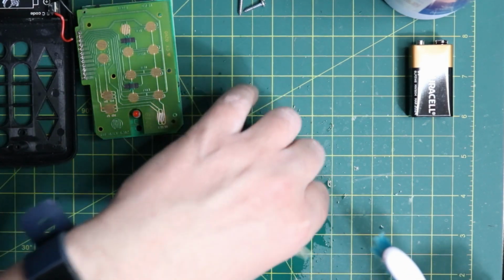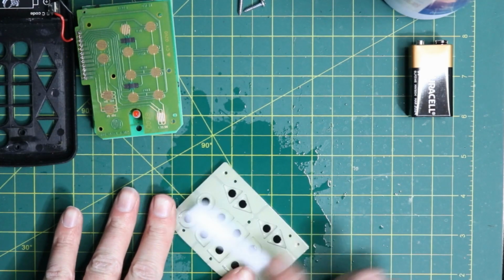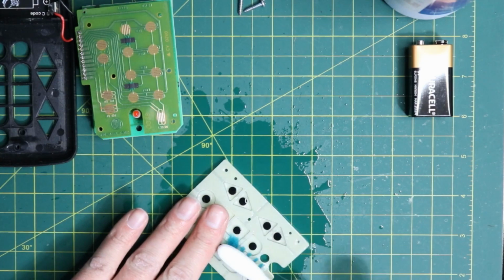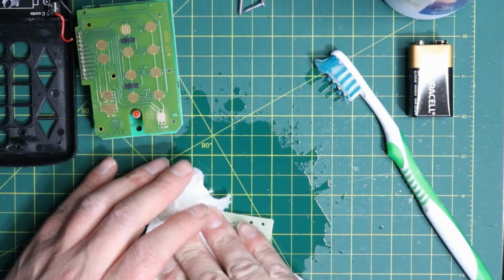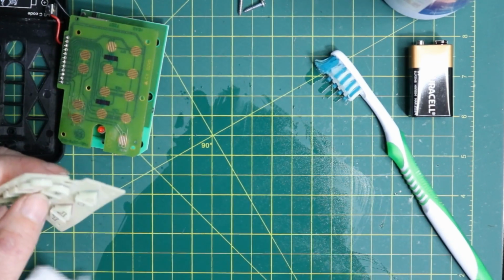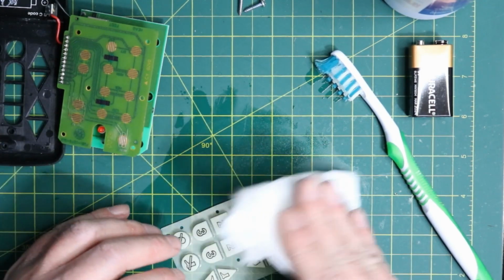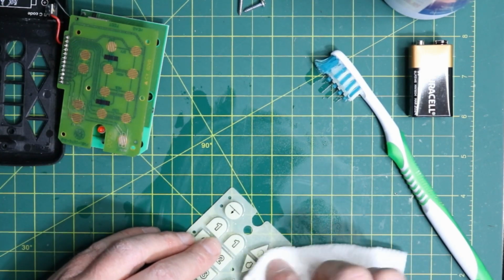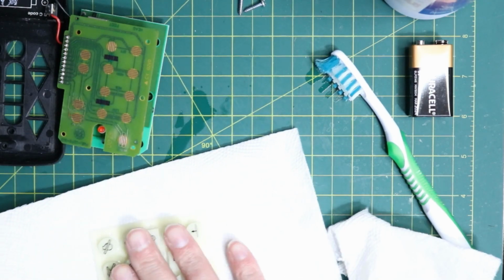As well, if anyone has any options for testing these RF boards, what kind of setup would be ideal for doing so, let me know in the comment section there. Usually I would have the bed for testing, but right now with COVID and everything, I find myself with more of these remotes that I'm unable to test. So if anyone's got any ideas that might work really well, let me know.